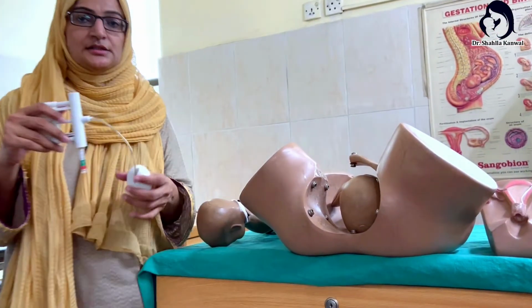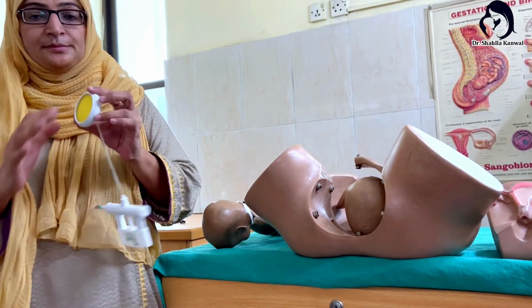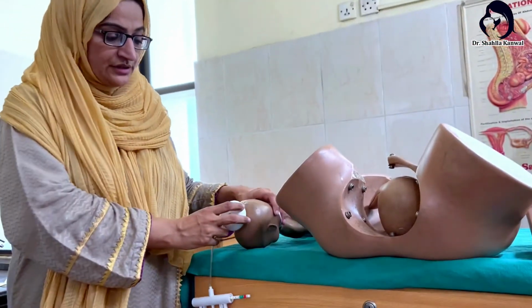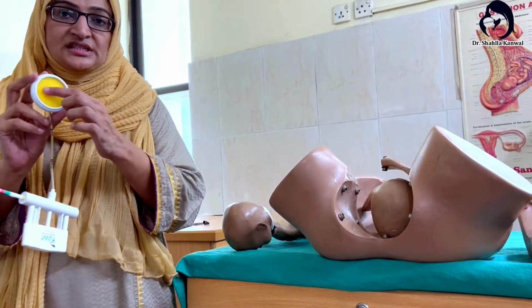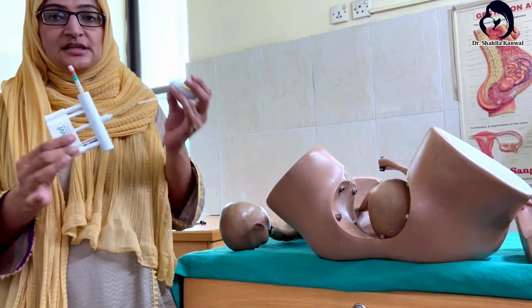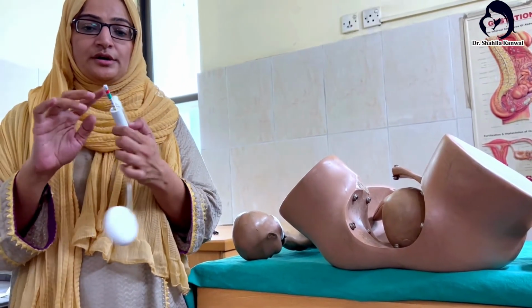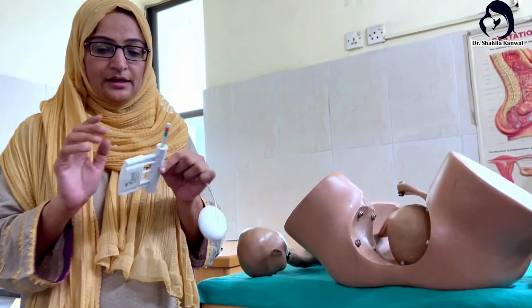After that, this is the Omni cup. This is a foam cup which has to be applied over the fetal head. Then this is the suction tube, this is the suction operator. Here is the pressure, or how much pressure you have to apply over that.